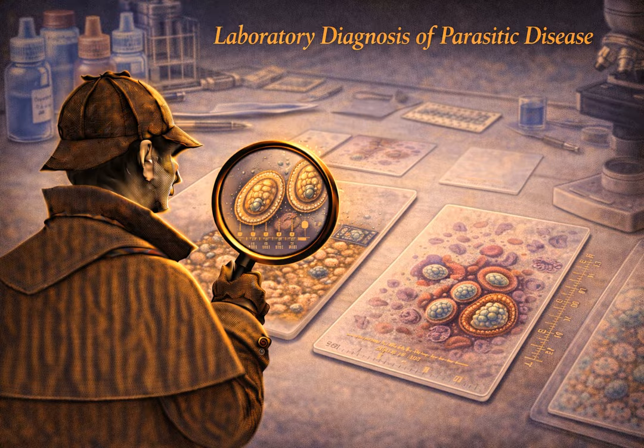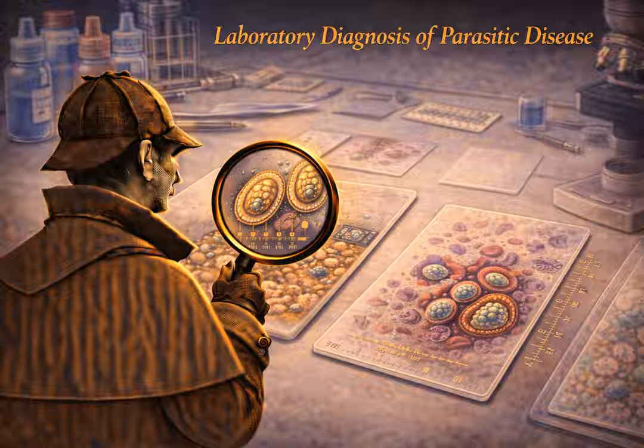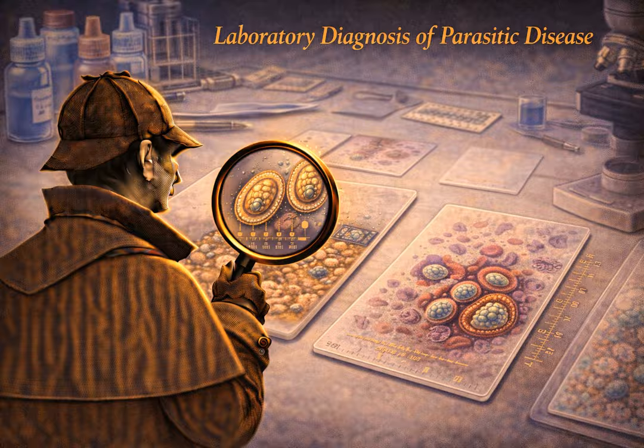Got it. Step 2 of the protocol is concentration. Think of this step as the sieve. In a mild or light infection, there might be very few actual parasites swimming in an absolute sea of normal fecal debris and bacteria. If you just look at a direct smear, you'll likely miss them entirely. We have to separate the gold, the diagnostic cysts and eggs from the dirt. And how do we break the laws of physics to actually separate them out?